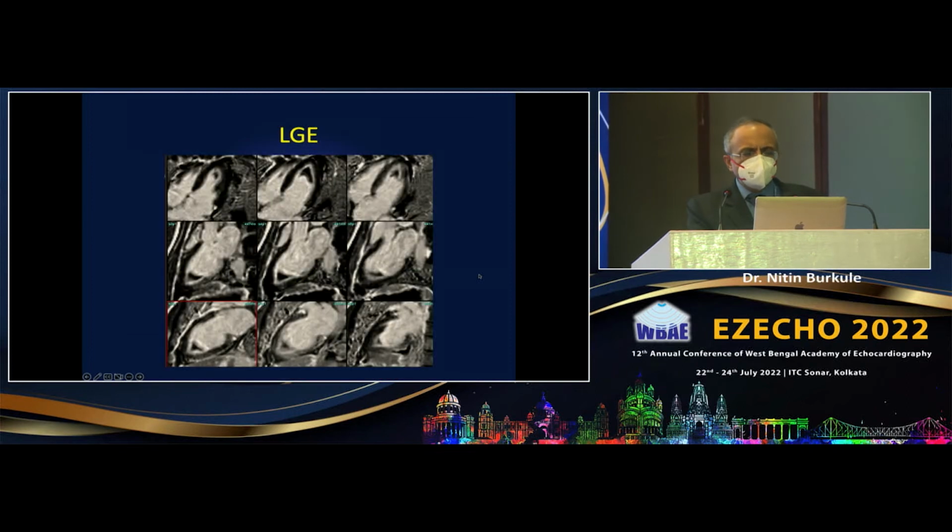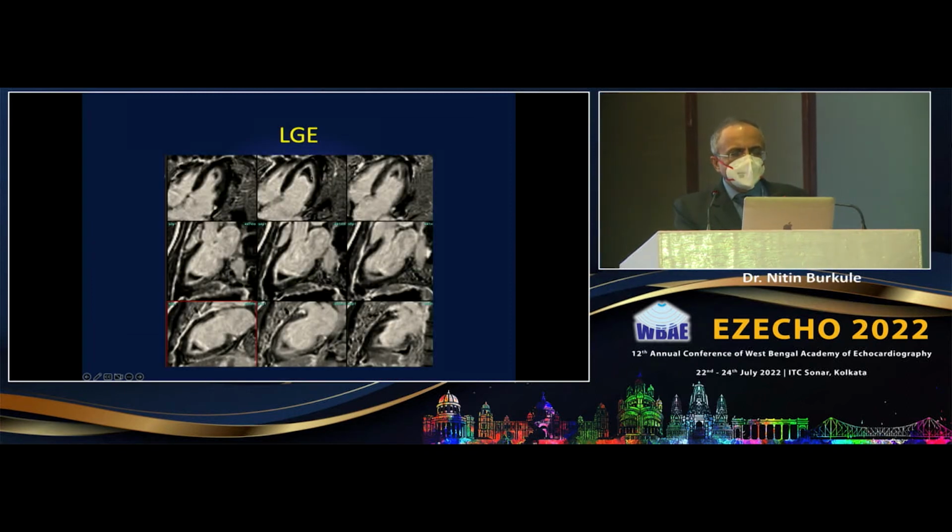So the moment we look at the late gadolinium enhancement, you see the same thing. You have got this clot. Between the clot and myocardium, there is an LGE, which is called the fibrosis because of the endothelial injury, and a normal myocardium. So the second cause for a late gadolinium enhancement in the subendocardium after the infarct is the hypereosinophilic syndromes or the Loeffler syndrome.